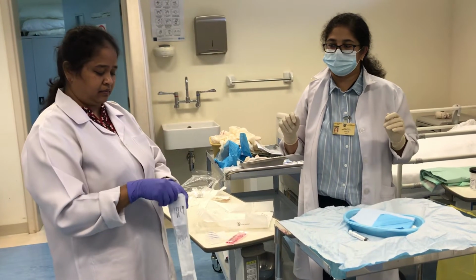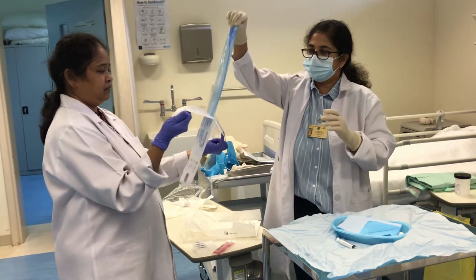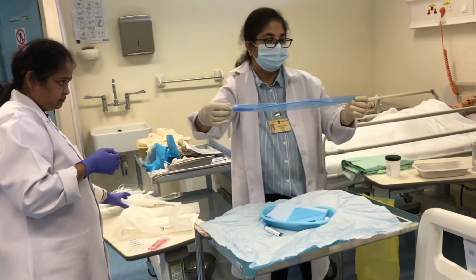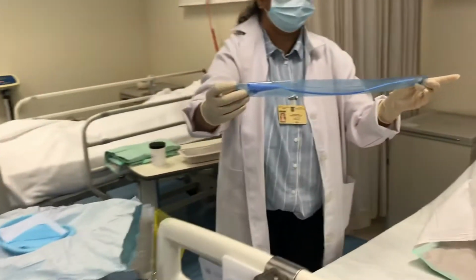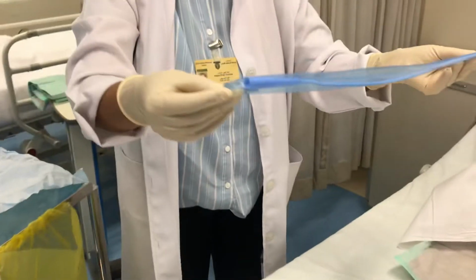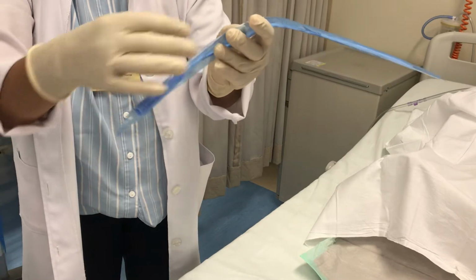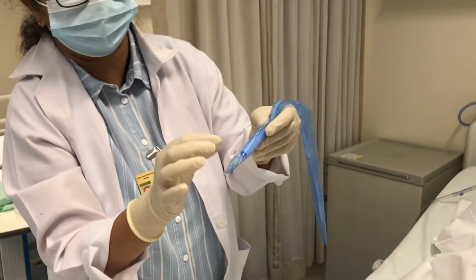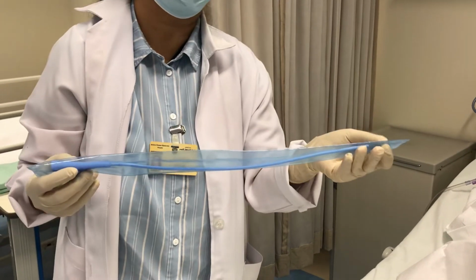Now it's the preparation of the catheter as such. Here, if you can see the catheter, it's very interesting to see the inner cover of the catheter, because this could be opened at our necessity. We can open it from the lower part, and also from the upper part.